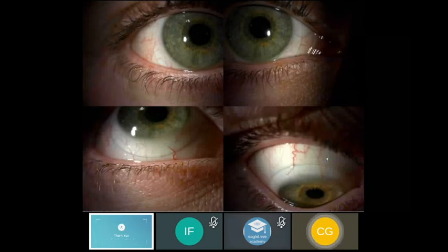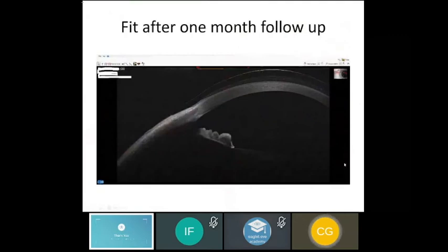Here's a picture of the lens on the eye in all directions of gaze — everything looking quite good. At one month follow-up, the central clearance was about 100–150 microns, which is ideal, and the peripheral area was well aligned with the conjunctiva.